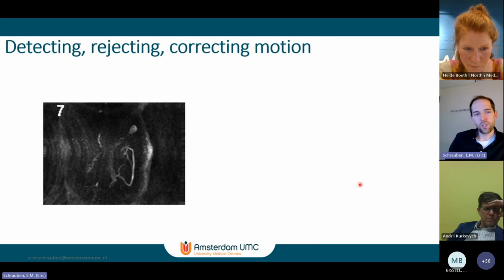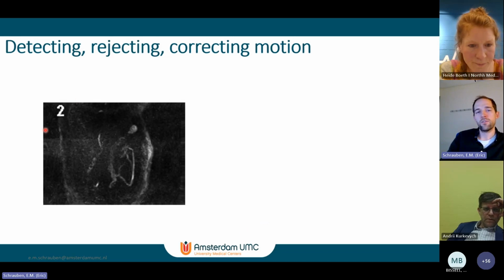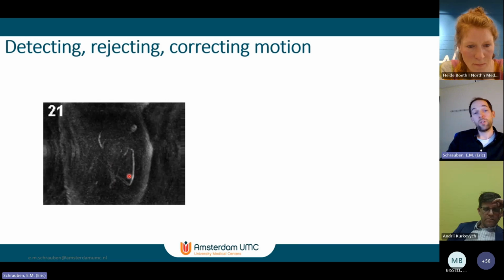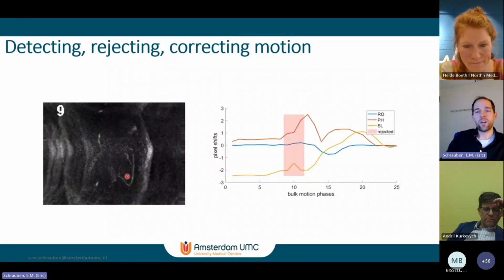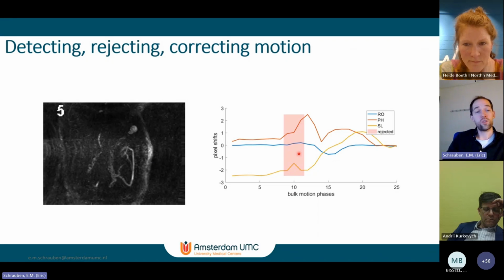So if we put this into the motion correction pipeline, here are the bulk motion bins over time, where again, each bin is around 15 seconds of data. And we can identify quite a bit of motion, including a few bins in the middle there, where we completely lose signal. So after registering these together, we can derive motion curves for correcting data, as well as a few of these bins where signal is lost that we can then just reject.